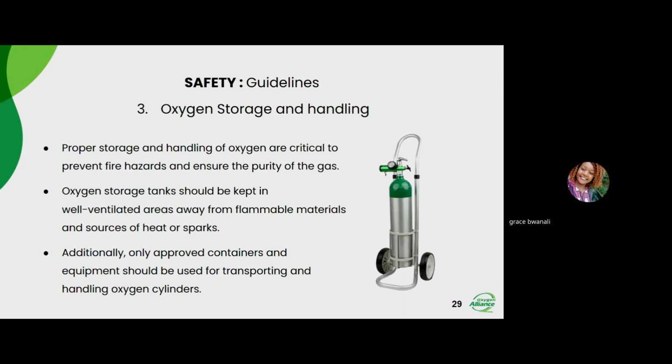Additionally, there are approved containers that can be used for cylinder storage, I mean for oxygen storage. So we need to make sure that we are using the right containers for keeping this oxygen.